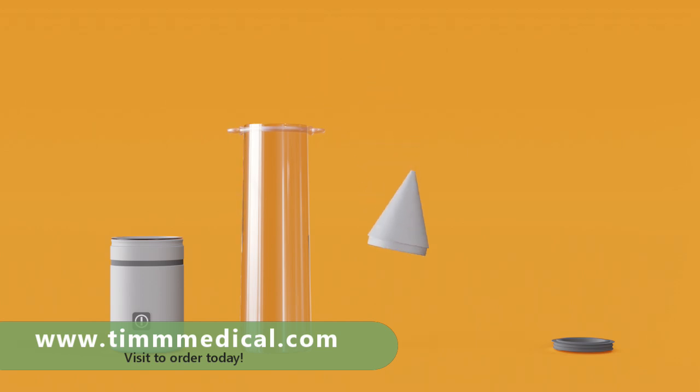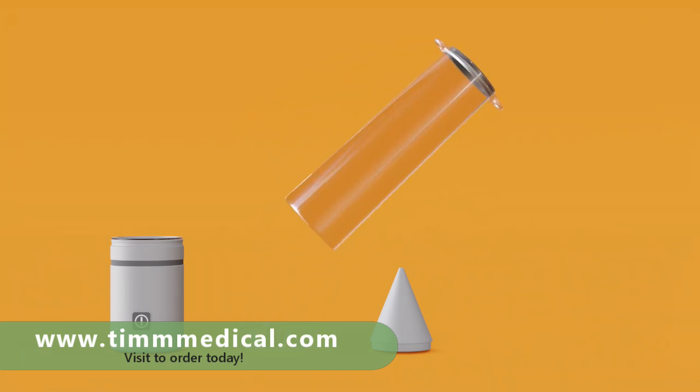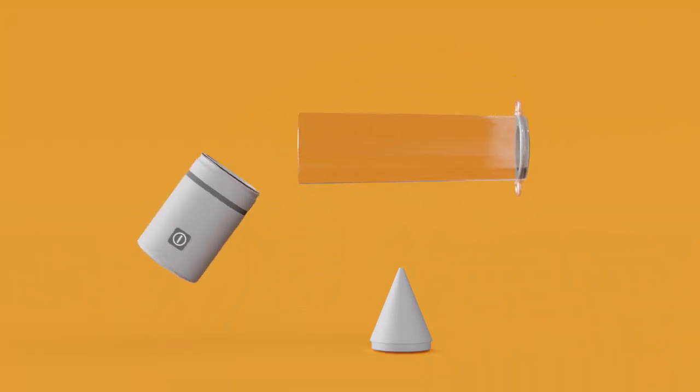Remove the cone. Insert the adapter bushing into the end of the tube. Place the pump head on the other end of the tube.